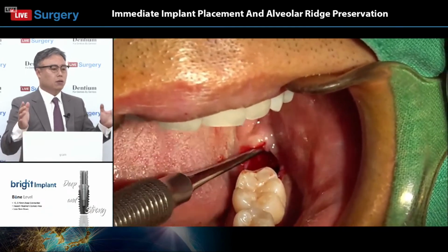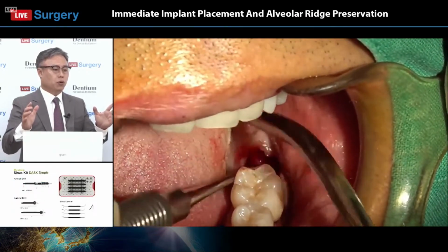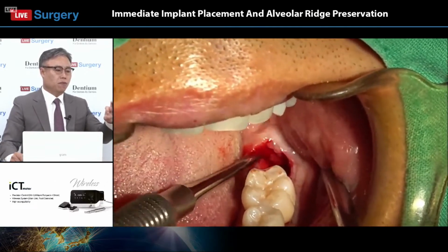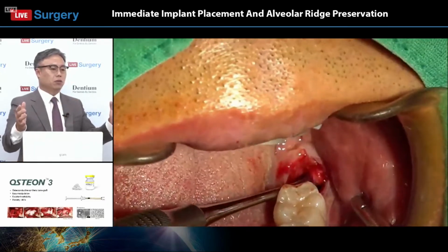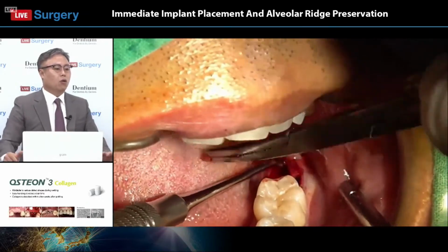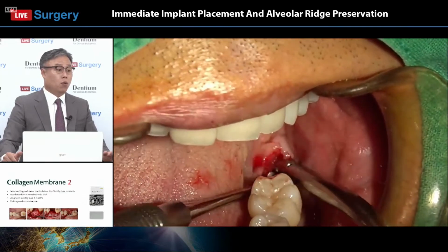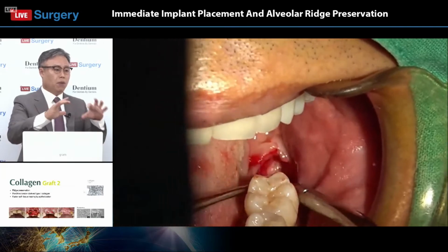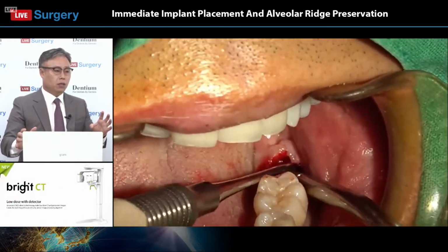The reason why thorough removal of granulation tissue is very important is that if there is some remnant of granulation tissue, with a lot of inflammation, before applying the bone graft, then according to the literature, even though we are applying the bone graft on the extraction socket, because of the inflammatory condition the bone graft will resorb very fast.